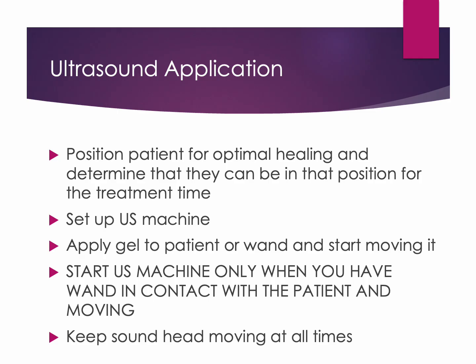1. Position the patient appropriately. 2. Apply gel to wand or patient. 3. Make contact between the wand and the patient. 4. Start moving the sound head. 5. Turn on the machine and keep the wand moving at a steady rate.